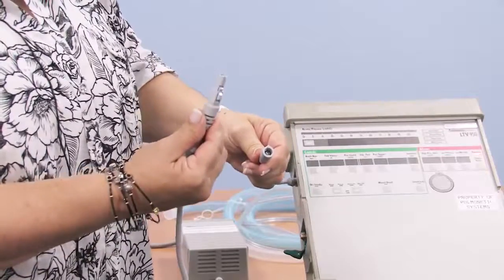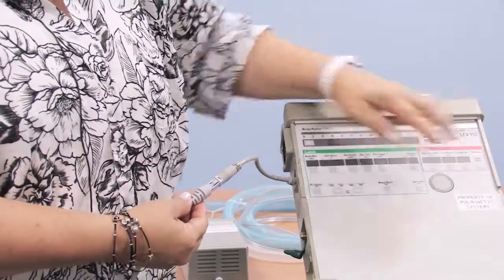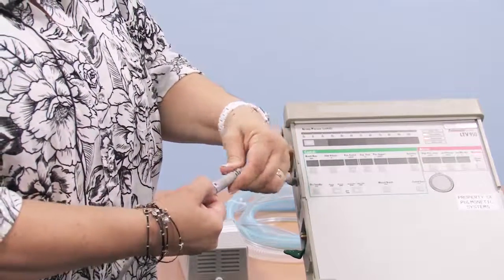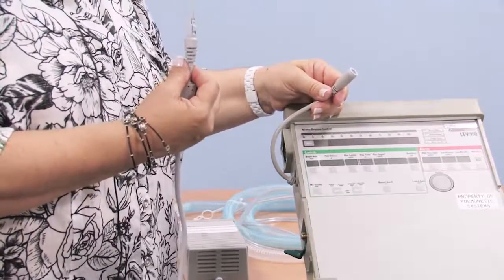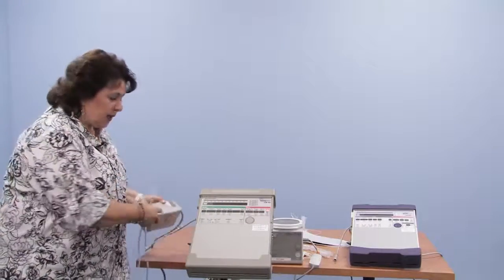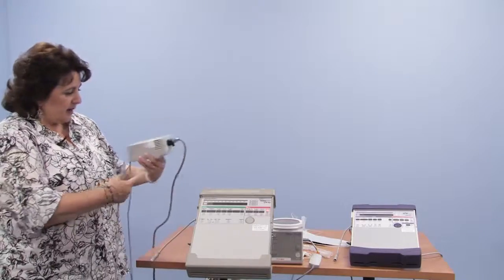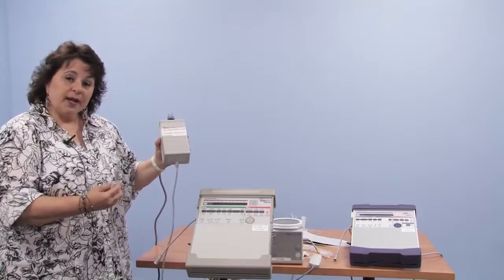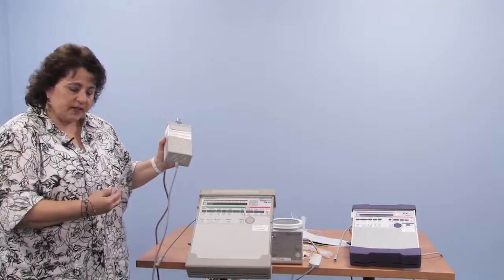The connector is quite delicate. It snaps into place. And although it looks like it sort of slides, it doesn't. It's a push and remove. So all sources of power for the LTV series ventilators will look like this. This is merely the wall plug. It may look like more, but this is the wall plug. And it does have a connection on this side and a connection on the wall. So please be sure that those are connected tightly if you find that there's a power situation with your ventilator.